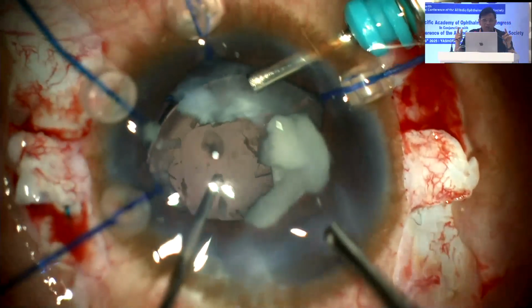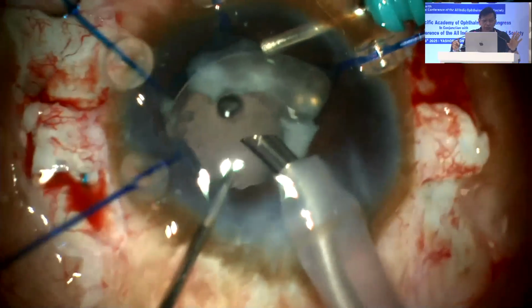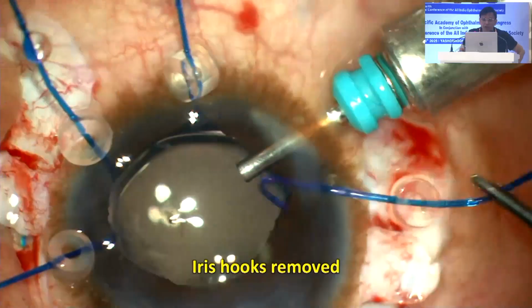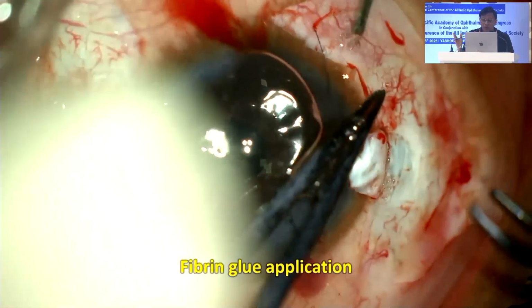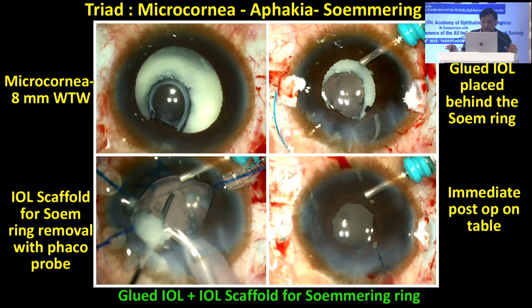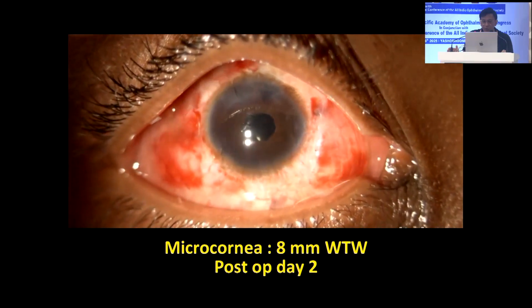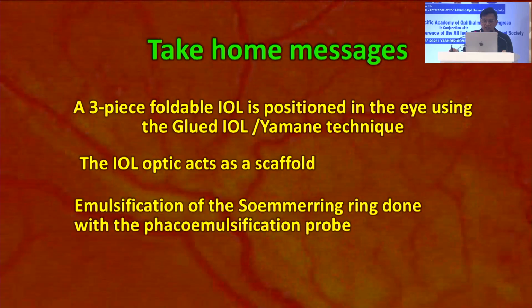But remember, the first step is to do the glued IOL or a Yamane scaffold technique. If you don't have that, the chances of the Soemmering ring falling down become very high. Now remember, these patients will by and large have nystagmus also. This is how the case looks when it's completed. These are the steps of the surgery which I have shown you. This is the patient post-op day 2. Remember, 8 millimeter white to white cornea, 1 week post-op, vision is 6/36.